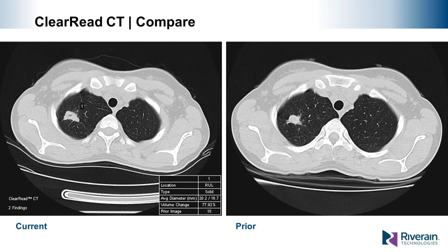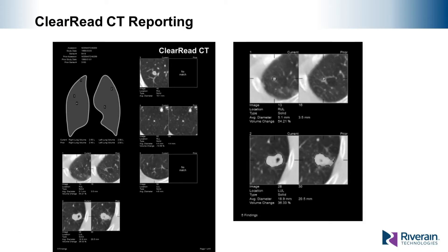With the ClearRead CT Compare application, we can detect a nodule in the current exam and then associate it with a corresponding location in a prior exam. By capturing two time instances of the same nodule, we can determine if the nodule is growing, how much the volume is changing, and offer estimates of volume doubling time. A full ClearRead CT Detect summary report is provided, including location, measurements, comparisons when available, and an image chip view for each finding.